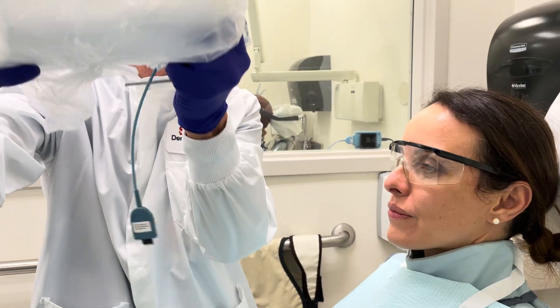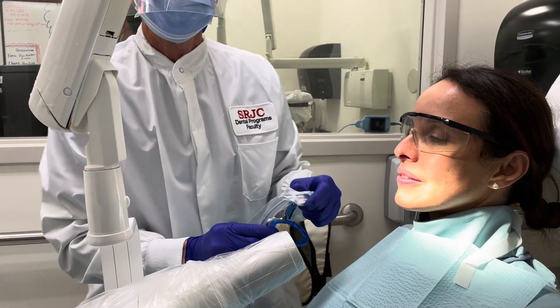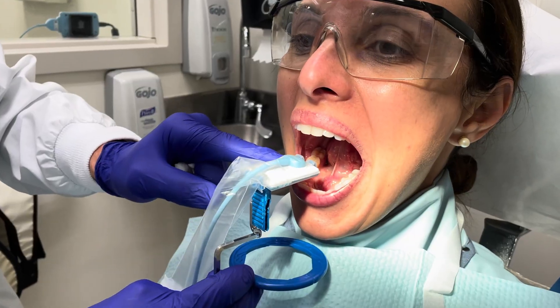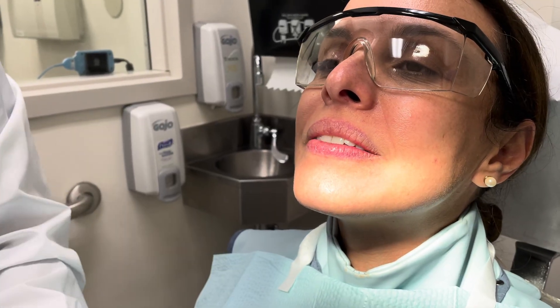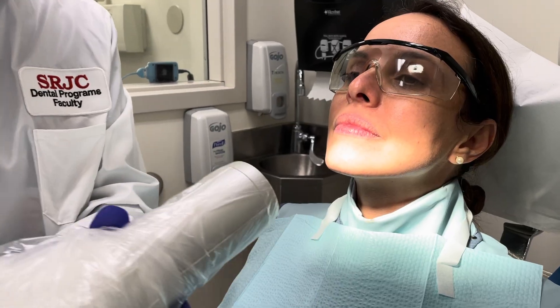Pre-setting. The lower — we can either go over the tongue or under the tongue. We're going to open; lift your tongue. She doesn't have too much of a frenum, so I'm going to go underneath the tongue. It's going to go straight back like this. And Maria, for this one, I'm going to have you tilt your head back a little bit. Having them tilt back means we're not going to get the entire PID right up against her chest. We have a little room here.